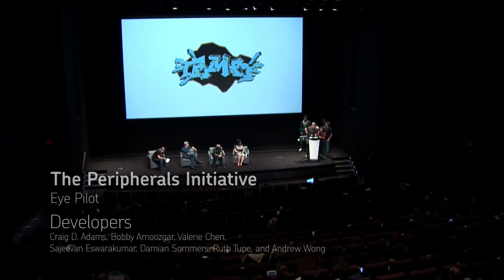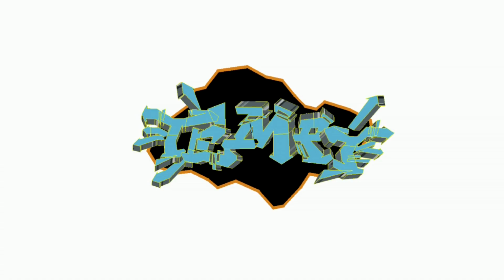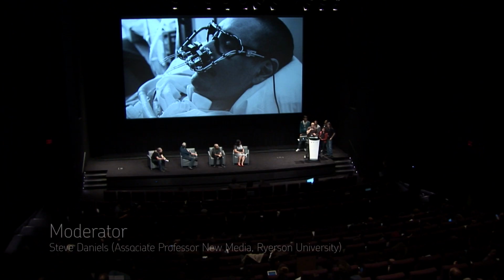We got brought together in a way by this image, which was painted by an artist using just his eye movements. It's this guy here, a graffiti writer in LA by the name of Tempt1. He was suffering from ALS and he was paralyzed. But some friends of his banded around and got this really affordable optical control peripheral, basically a webcam and some infrared LEDs. And he was able to paint using just his eyes. It's kind of inspiring.